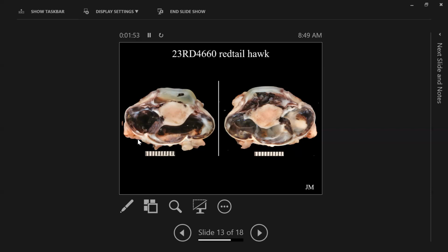At the back, there are some defects in the sclera, kind of to the left-hand side. It's a little bit discontinuous. We can see that on the right-hand side as well. Another section, again, mass in the center, some sort of irregularity to the sclera at the back of the globe. And then in this right-sided picture, if you look kind of beyond into the back, there do appear to be some white masses in the back that I also have some sections of to look at.